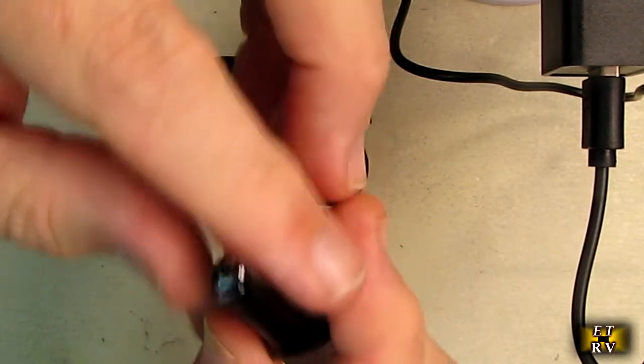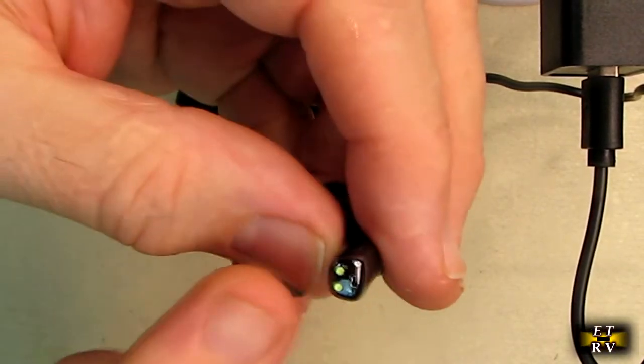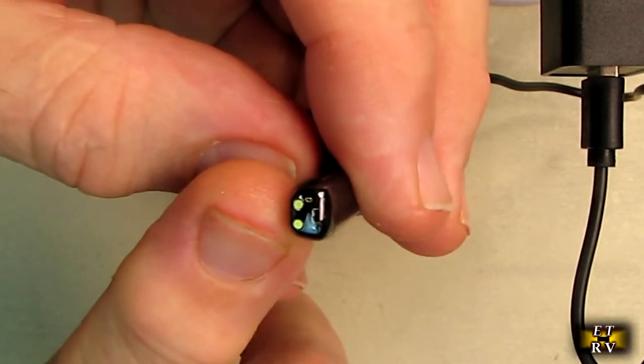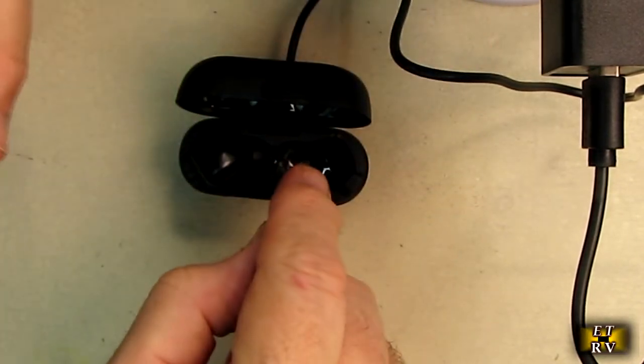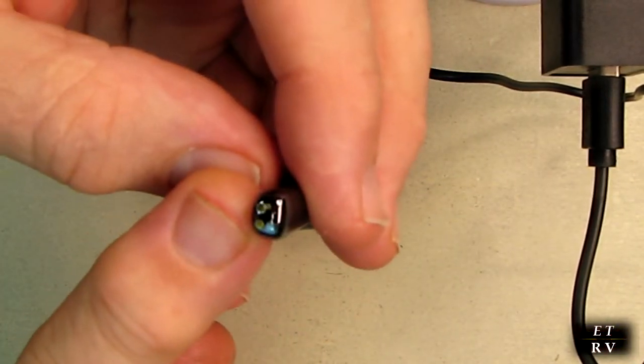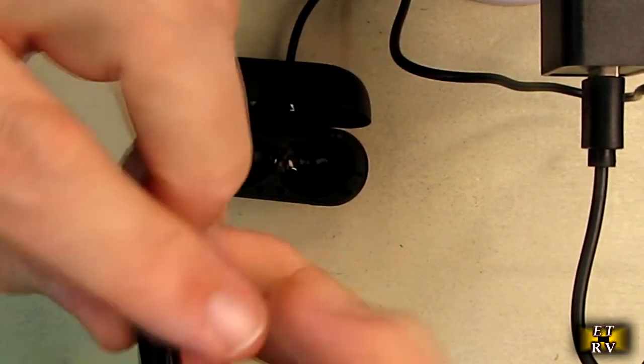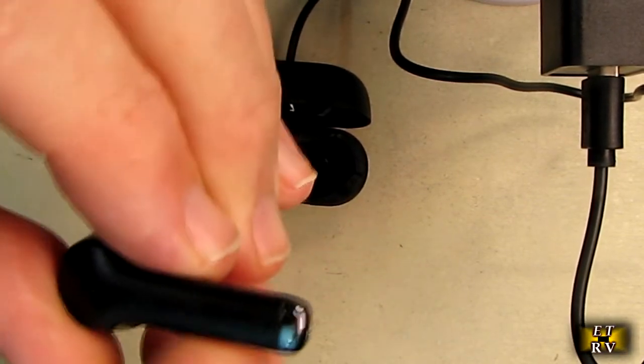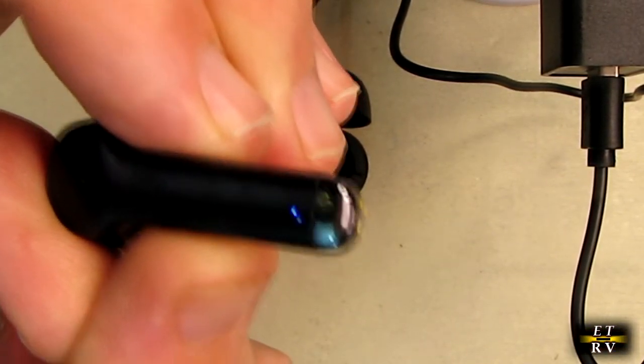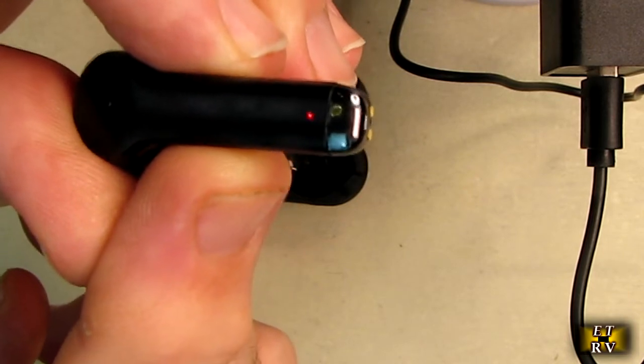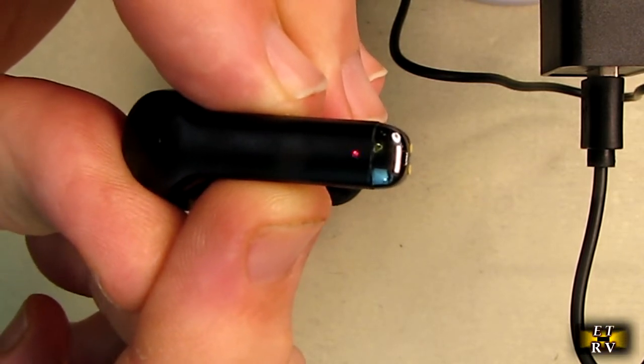On the bottom you can see the little gold contacts that receive energy from the charging station. If you look closely, you'll see a blinking LED that's actually trying to connect to my Pixel 6.